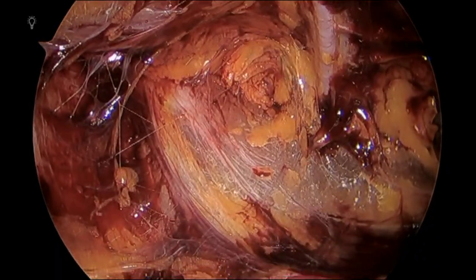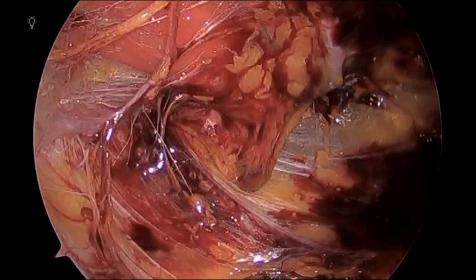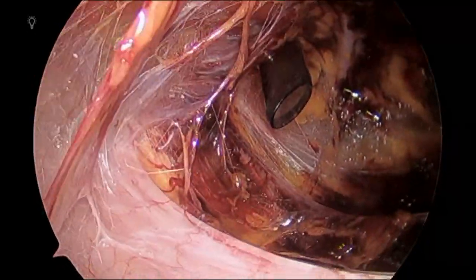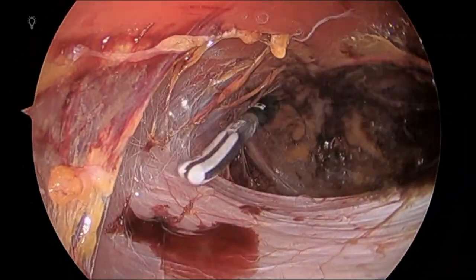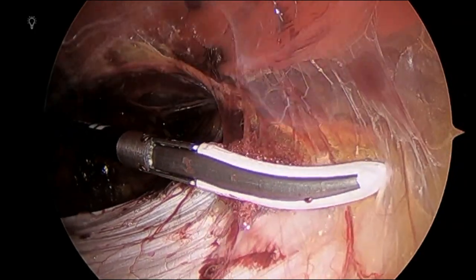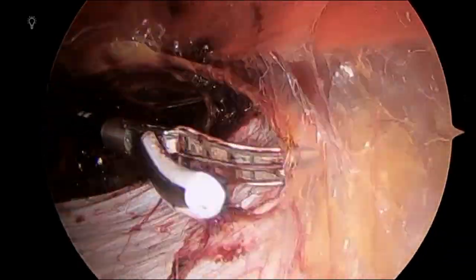Once I have achieved enough space and I'm comfortable with it, I will introduce another 5 millimeter port to continue the dissection in order to create enough space in the left retrorectus space and in the rectus space and do the crossover in the suprapubic matter.